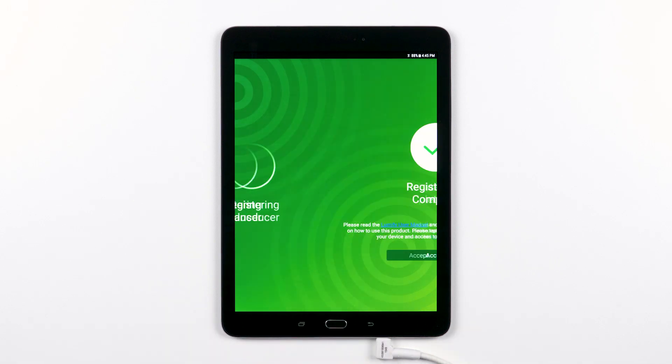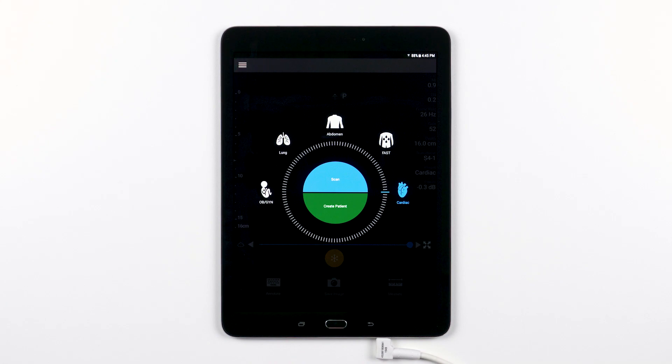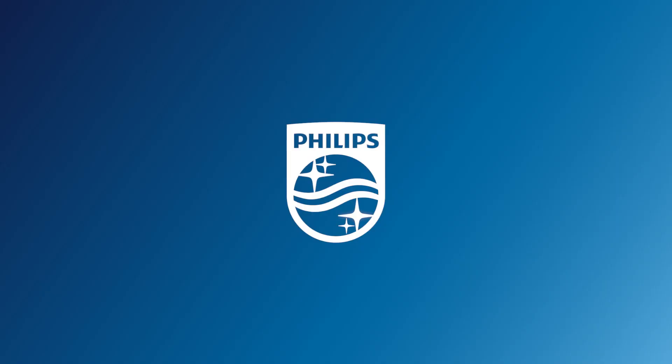This next screen with a big check mark is telling you that everything checked out and your transducer was successfully registered. Feel free to hit Accept or click on one of the other links if you like. Now that your transducer is registered, anytime you plug it into your device, the Lumify app will launch automatically, allowing you to scan right away. You're now ready to begin using your Lumify ultrasound system.